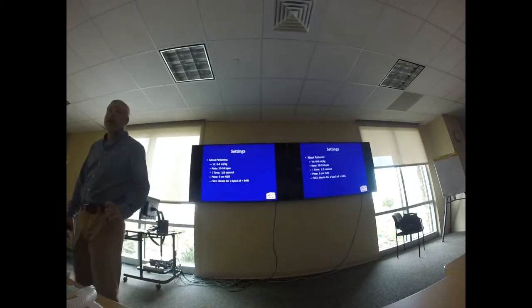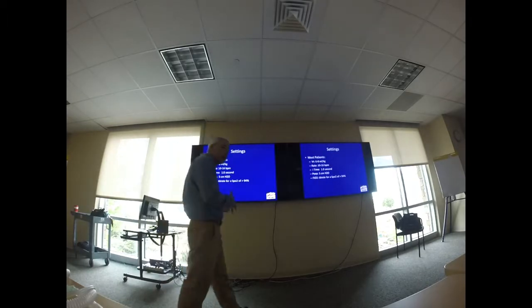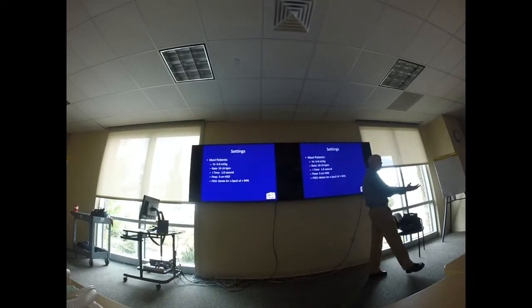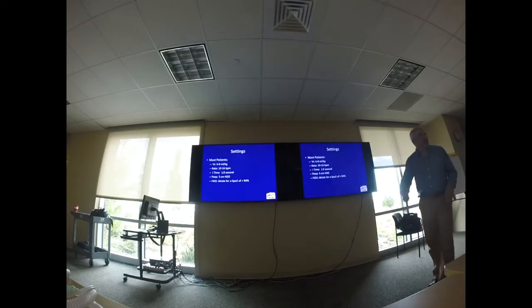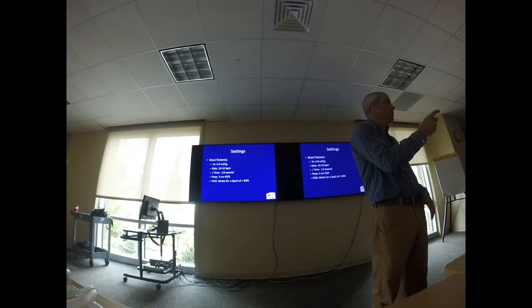You know, you guys, here's what I do too, and this is just like a little cheat. I have primary and secondary, right? So let's say we're working together, Mark, and I'm going to be primary, you're going to be secondary. So primary, I'm going to take a report from the nurse. You're going to start getting them on all of the equipment and all that kind of stuff. You know what I want you to do first? Take the monitor, turn it on, take your end-tidal CO2 and plug it into their ventilator circuit.